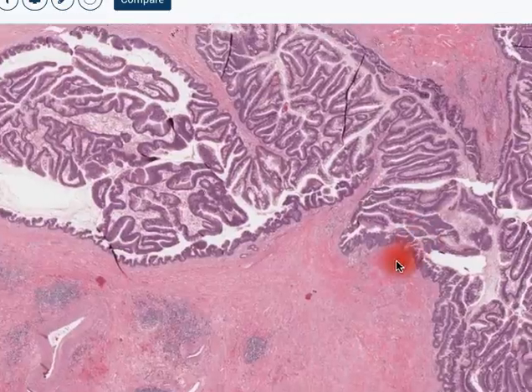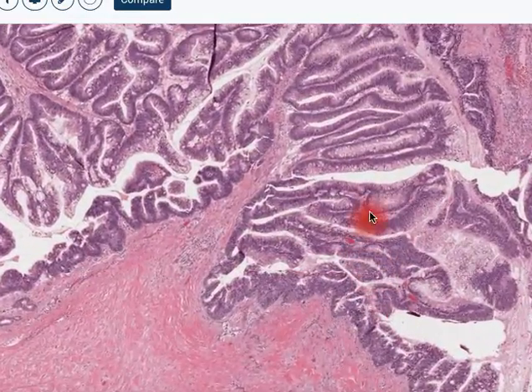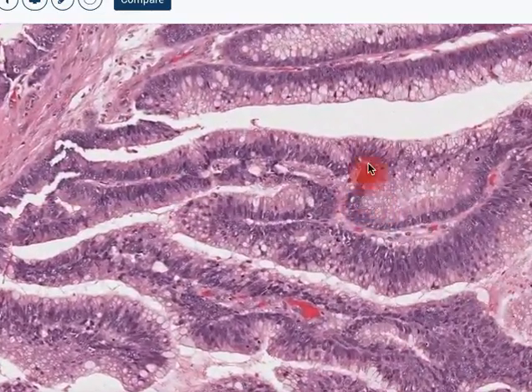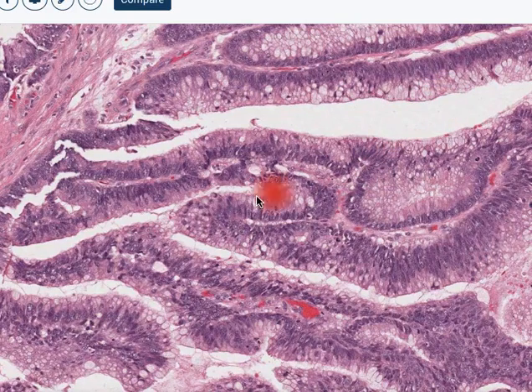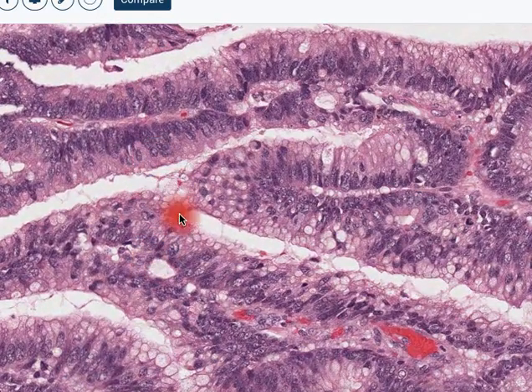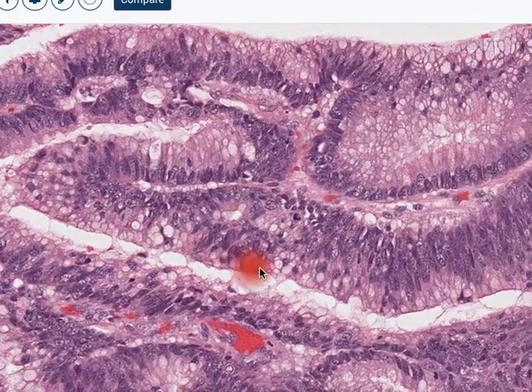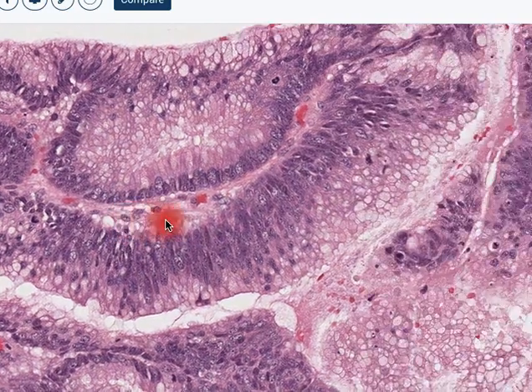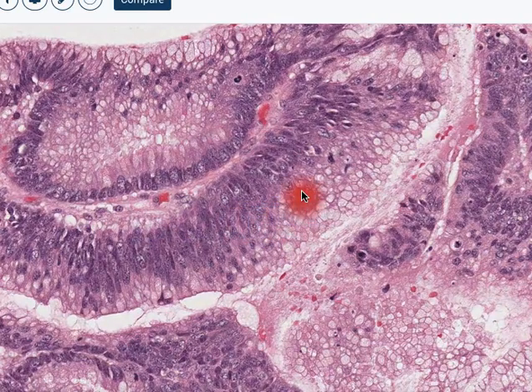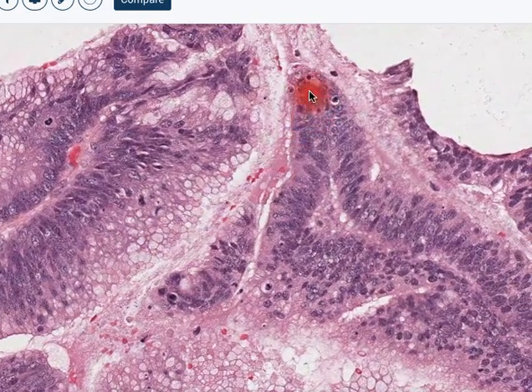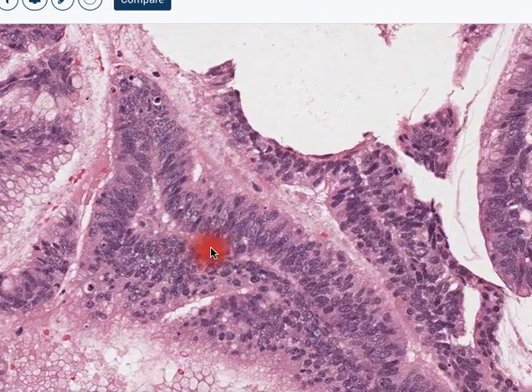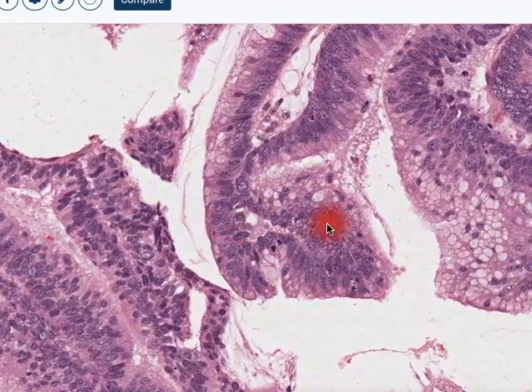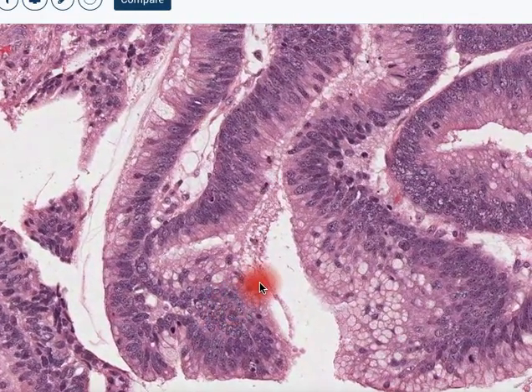Coming back to low magnification, we'll look at this intraductal process. We see that the epithelium does have a mucinous character, but there is quite a bit of stratification and some nuclear atypia. Most of the nuclei are still relatively basally located, and most of the cells have some cytoplasmic mucin, but we see mitoses and little bits of karyorrhectic debris.